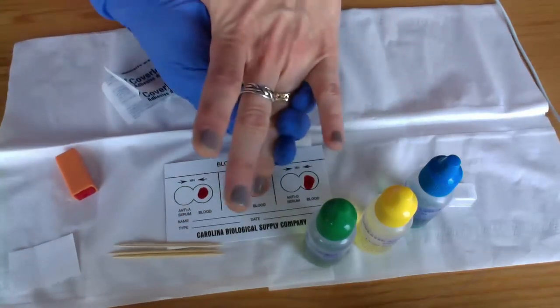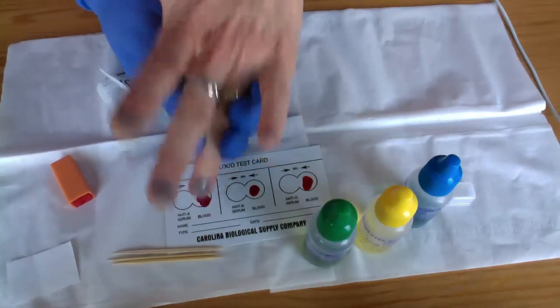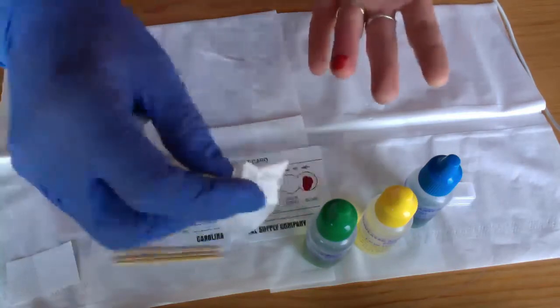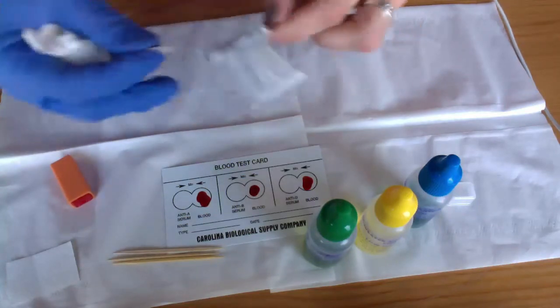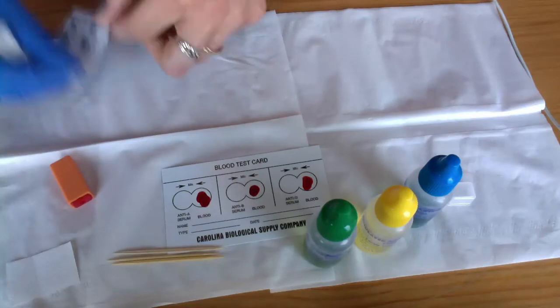And you don't have to do quite as much as I did. I was really trying to get a good sample to show you. I usually have a paper towel or something to clean off my finger. And then of course you're going to put your Band-Aid on so you don't continue to bleed everywhere.